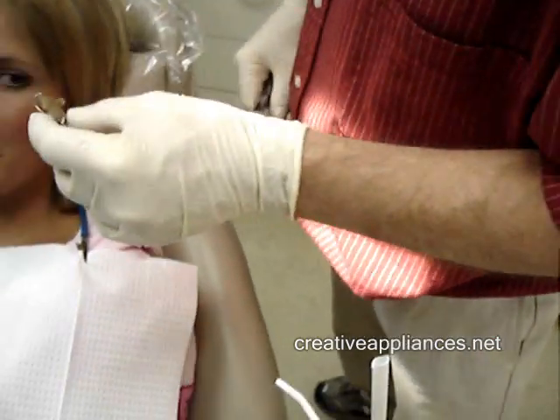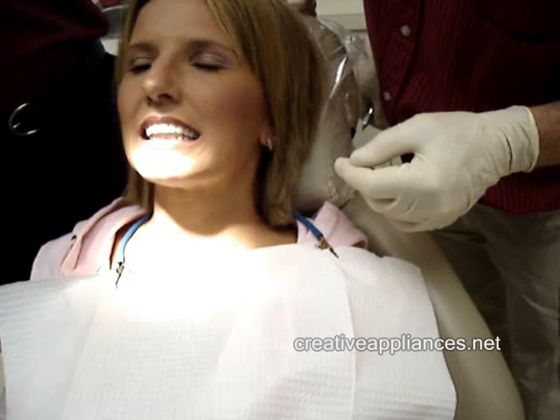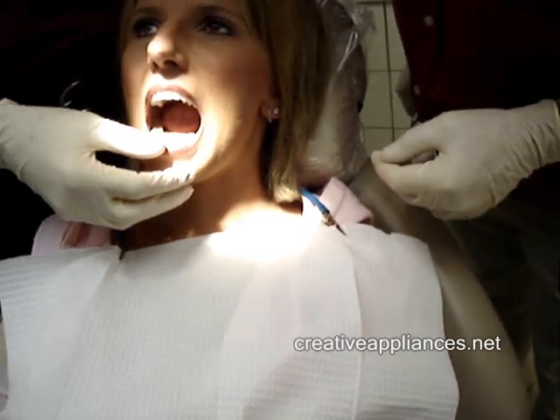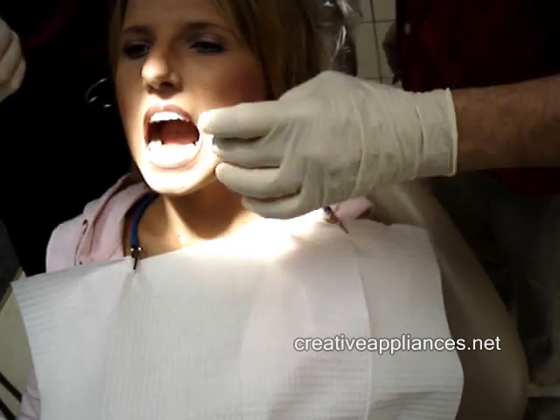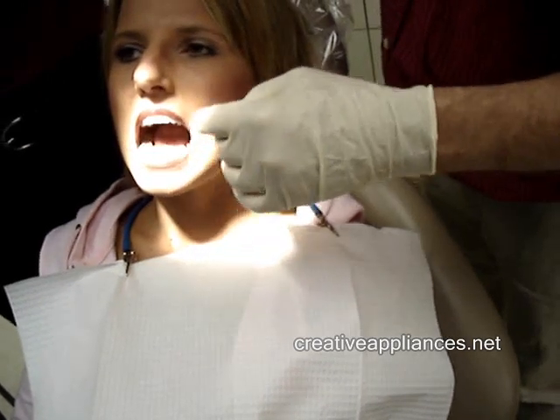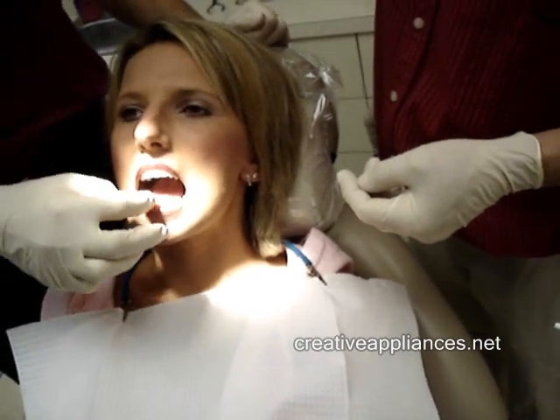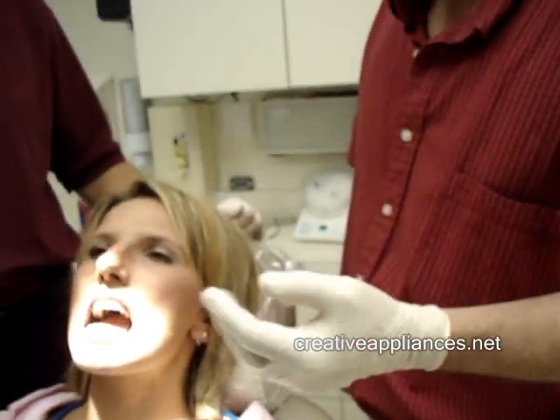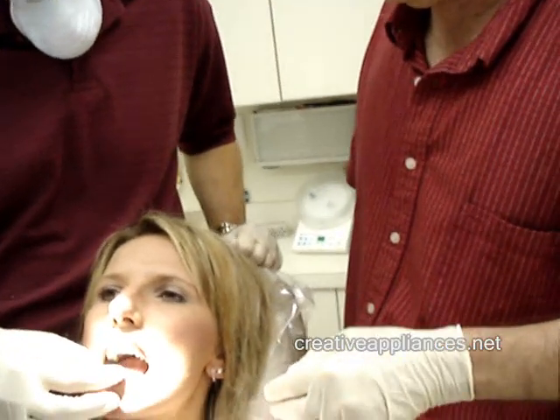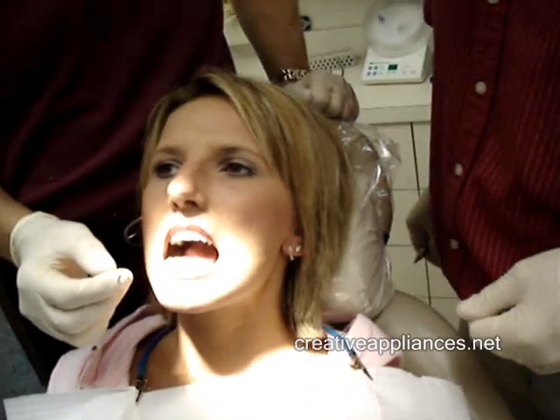I'll have to try that again — I've got some acrylic on in here. Let's take a look. Can you open down? So now we've created space all the way across. Is there any concern about anything moving too far labially? Probably not. All the teeth started labially except for that one that we left there. So where they want to go, their memory will dictate going back. So we're fine leaving it like that. It opened up that space now to where this lateral has room to move out towards the bow.